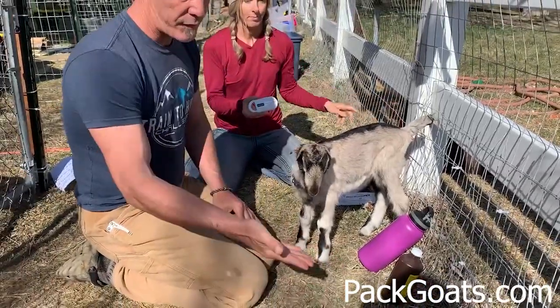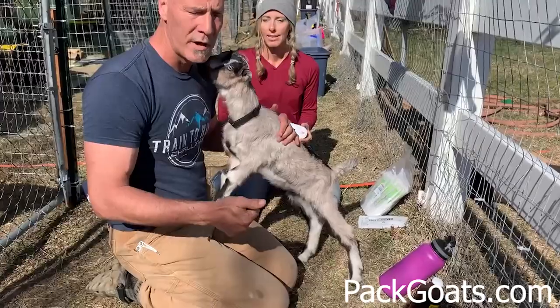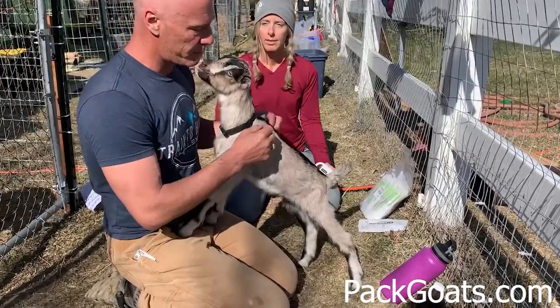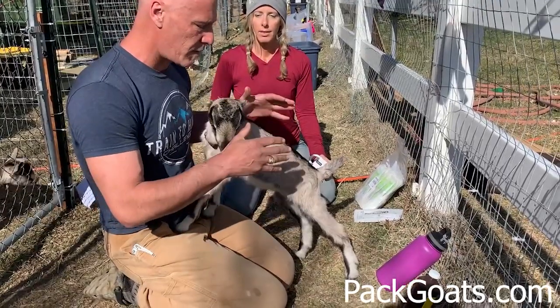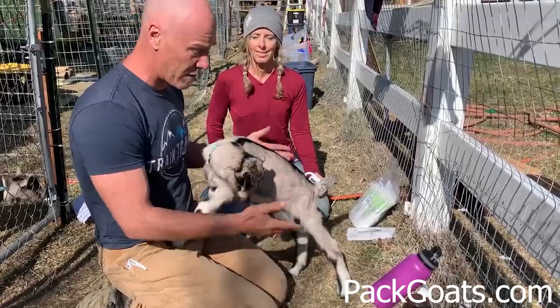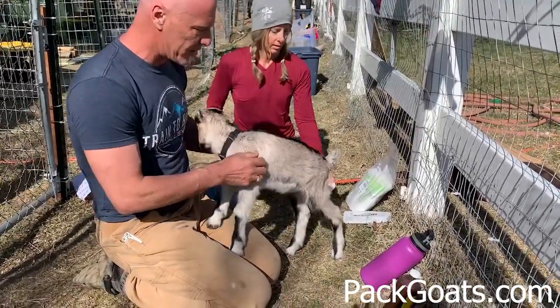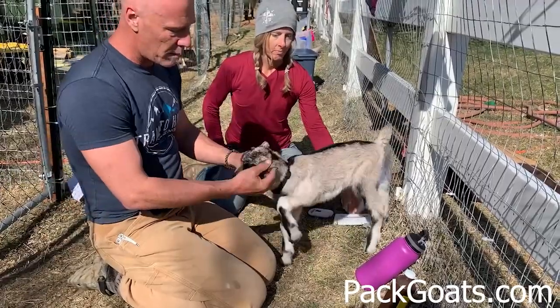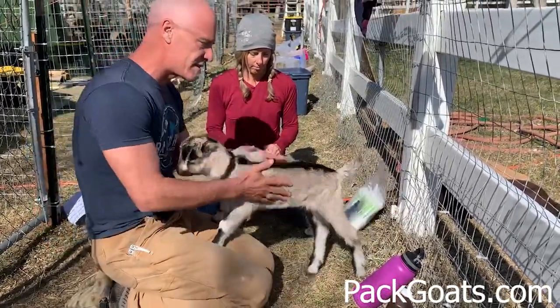I've only done four — I'm no veteran at this — but I've tattooed and I've done ear tags, and by far this is the least invasive, easiest process. These guys barely make any noise. I'm surprised how well it's gone because the gauge of that needle is fairly thick and it's been no big deal. And if you've got La Manchas or La Mancha crosses, they don't have an ear to put an ear tag in anyway.